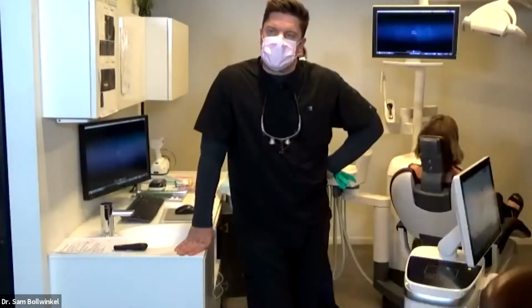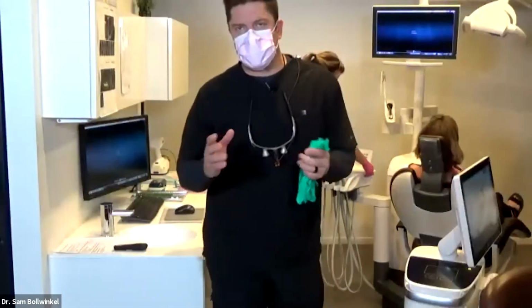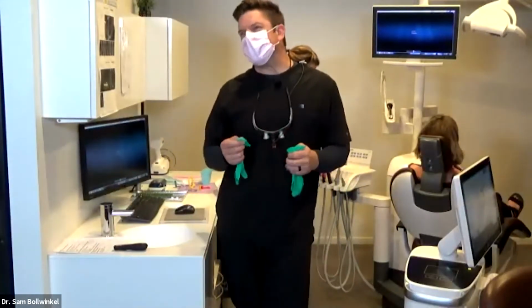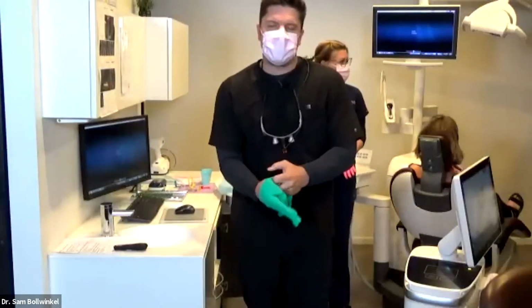Back, we've got our patient in the chair. We're ready to get going and demonstrate the 10-minute implant. Now, guys, realize we call it the 10-minute implant. The last time we did it was 5 minutes and 30 seconds or 6 minutes and 20 seconds. It might be 11 minutes, 12 minutes. We call it an average of a 10-minute implant.